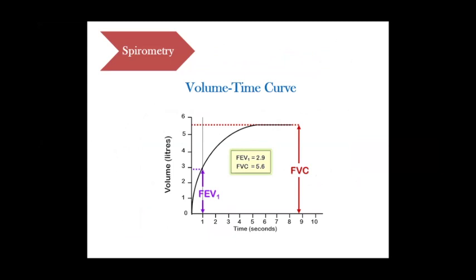What we should take into consideration here is that the patient starts exhaling from zero without hesitation, delay, or a leak, or a poor effort, in order to obtain an accurate forced expiratory volume in the first second of the maneuver.